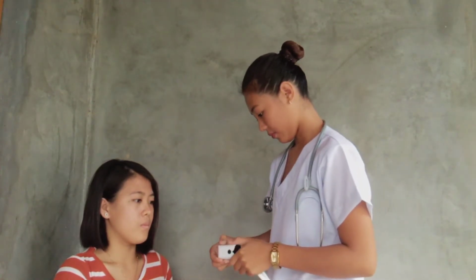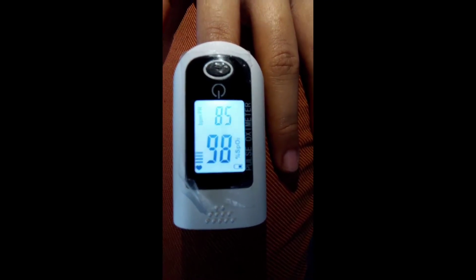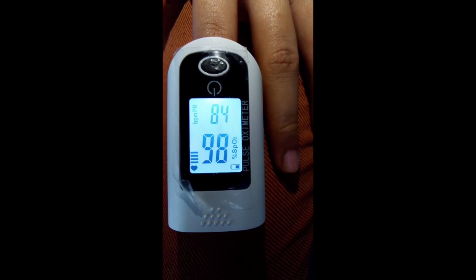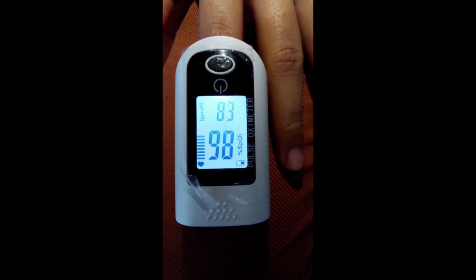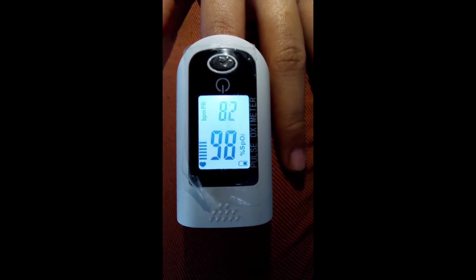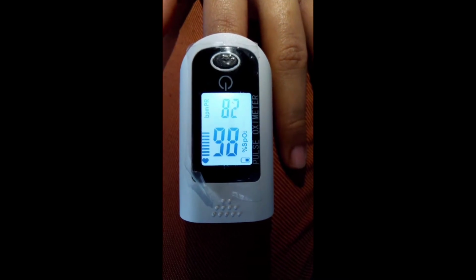We will be using this to determine the oxygen saturation of our patient by inserting his or her finger inside the device. The normal oxygen saturation is between 95 to 100%. The patient's oxygen saturation is 98% and it is normal. Also, we can see her pulse rate in this device.